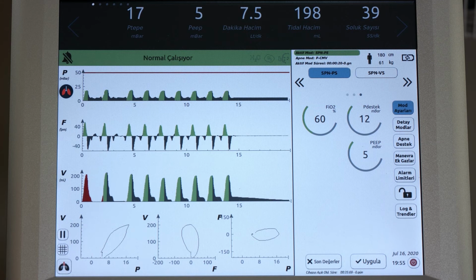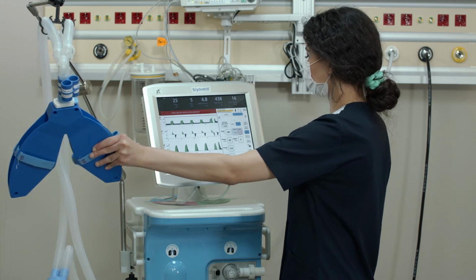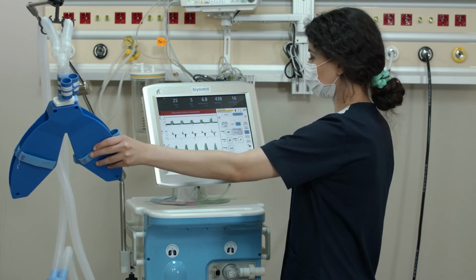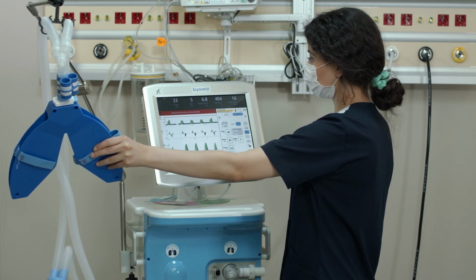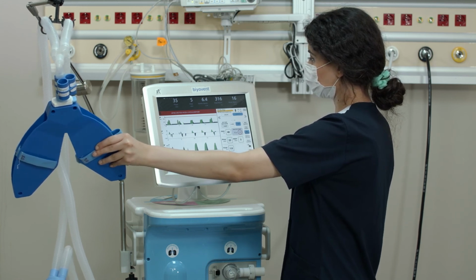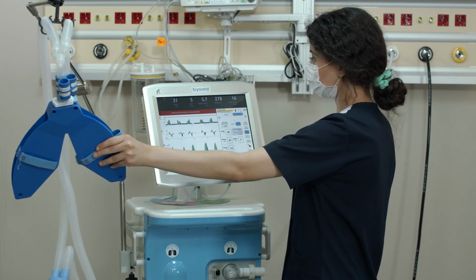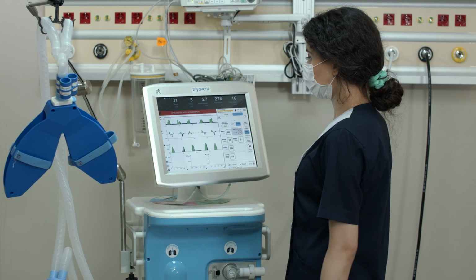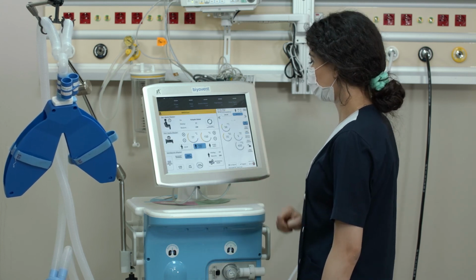After stopping the trigger, the device switches to apnea mode and gives an alarm. As seen, in case of triggering again, due to the unidirectional apnea feature, Biyovent does not switch to another mode and stays in apnea mode.